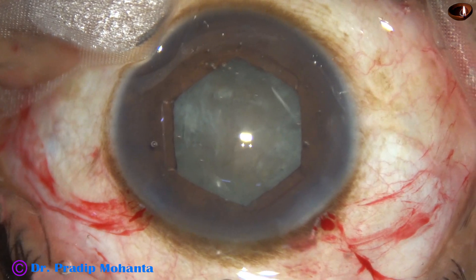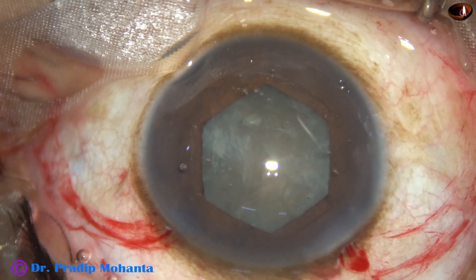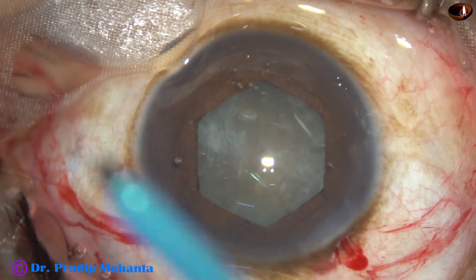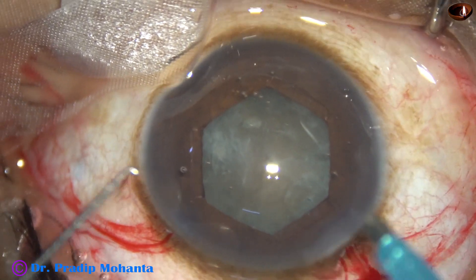Now here goes the phaco needle — this is a 2.2 mm needle going through a 2.8 mm wound.